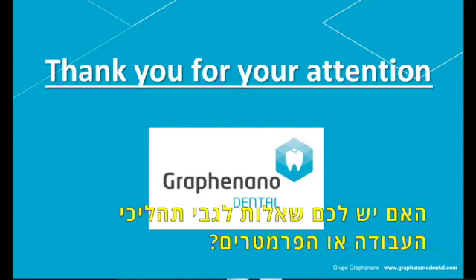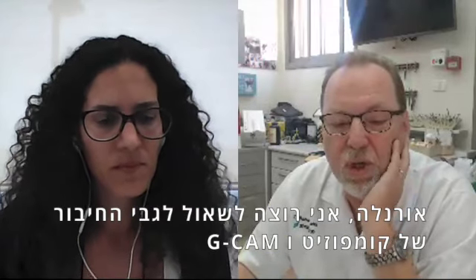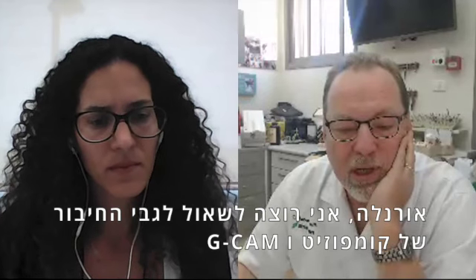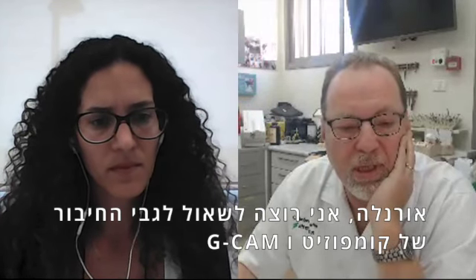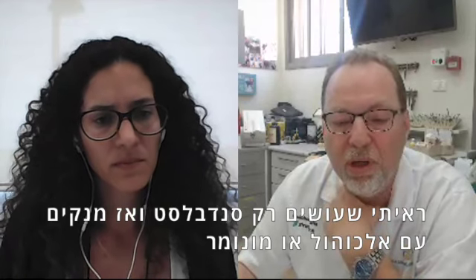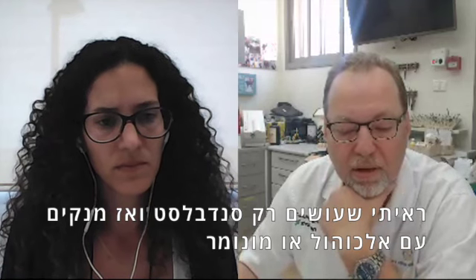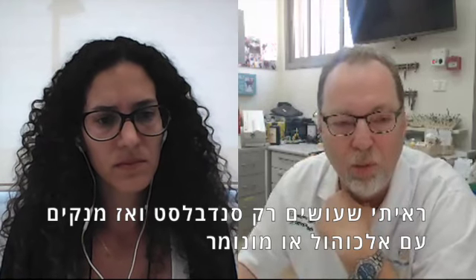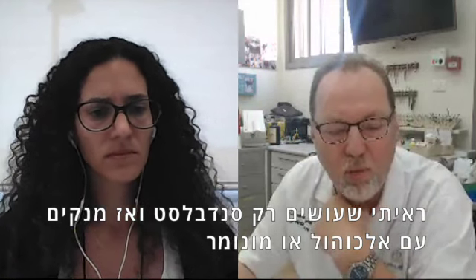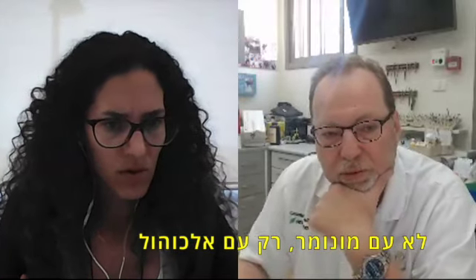I don't know if you have any question about all the process or parameters for GCAM. Ornella, I want to ask the question about the connection between composite and GCAM. I saw that you are making only sandblasting. Yes. And alcohol or monomer, you clean it with alcohol or monomer? Okay, monomer, no, only with alcohol, okay?